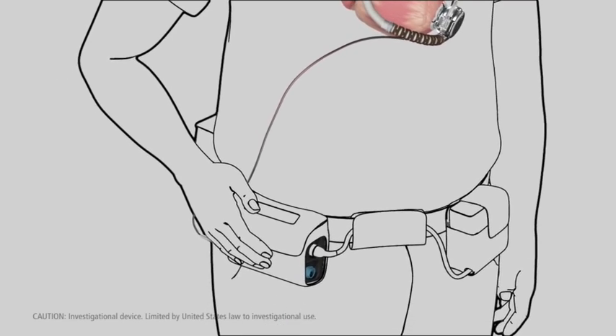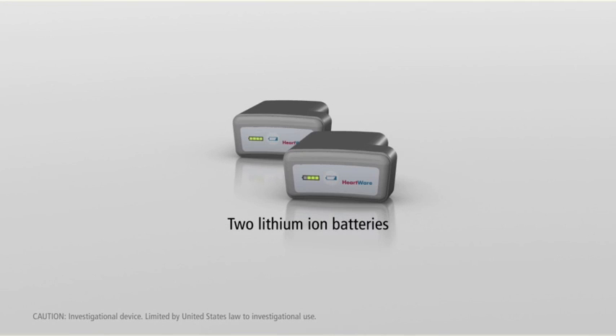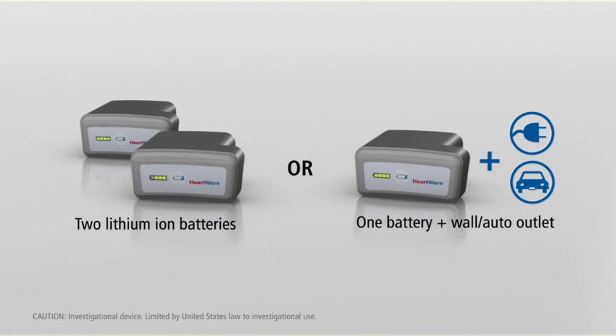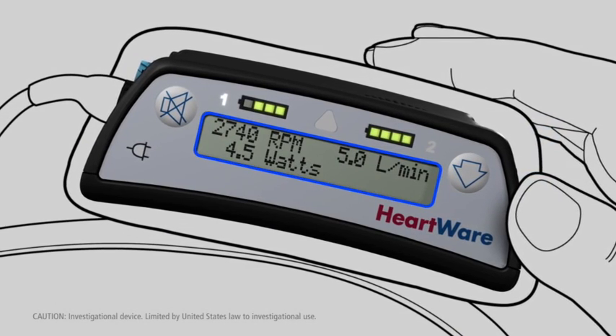Once in place, blood flows from the left ventricle through the inflow cannula into the impeller. It then exits through the outflow graft to circulate throughout the body.